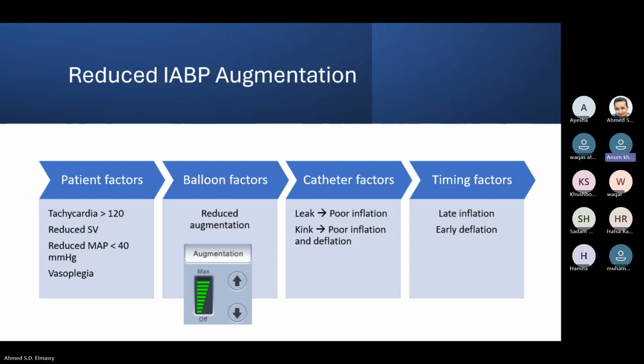Yeah, there is one recent one as well that offers the lowest ratio you can go for. Of course, it's the same concept, weaning by the ratio or weaning by the augmentation. So, in short, we can conclude that weaning by ratio is preferable as it's safe and easy, but weaning by augmentation won't be easy if you are not an expert, isn't it?